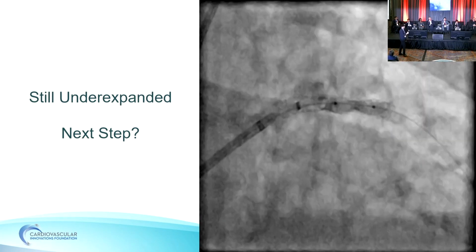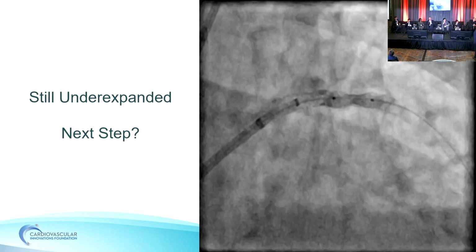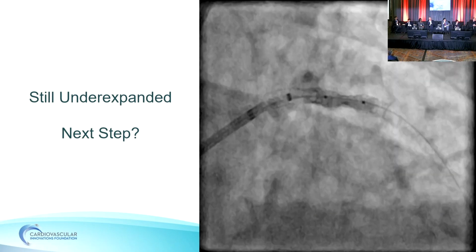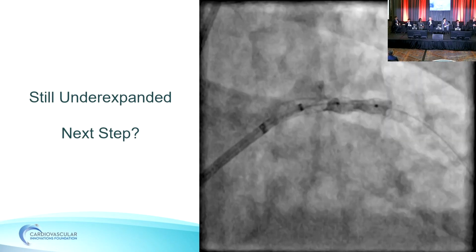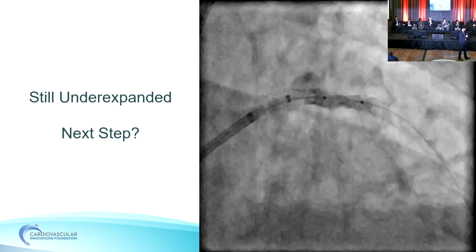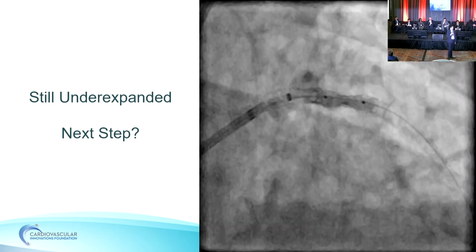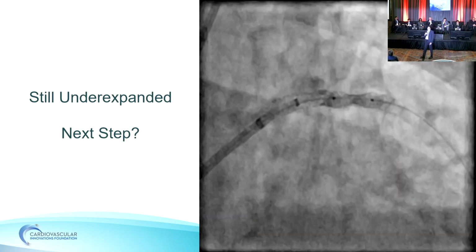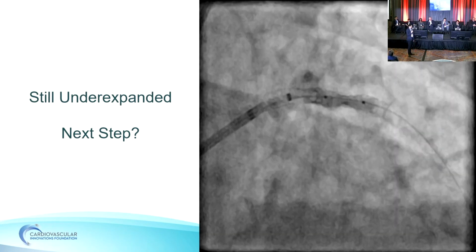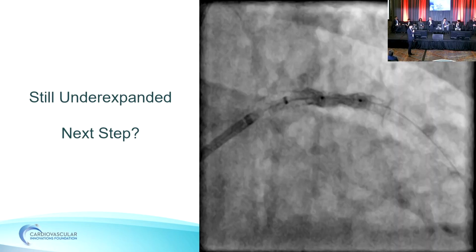Yes, Mike. Experience in Henry Ford where we used actually the peripheral CSI, like the solid crown, and it kind of cracked it. So I don't know what you would do next after that. Yeah, that's a great point, and that was certainly something we were thinking about, but we're more comfortable with Rota at this time. I think we have to turn to Rota at this time.